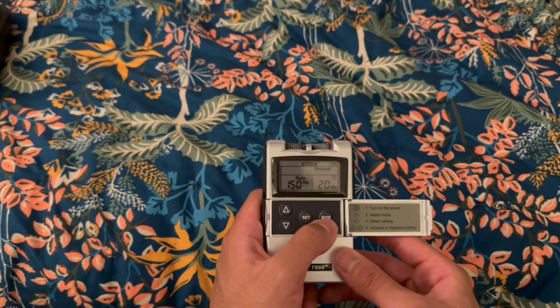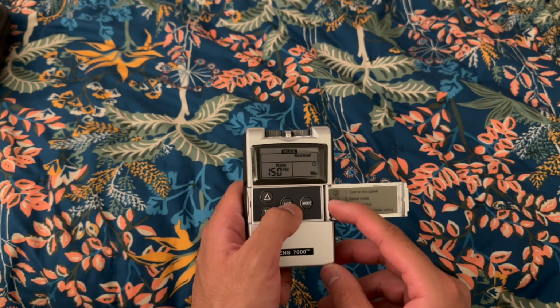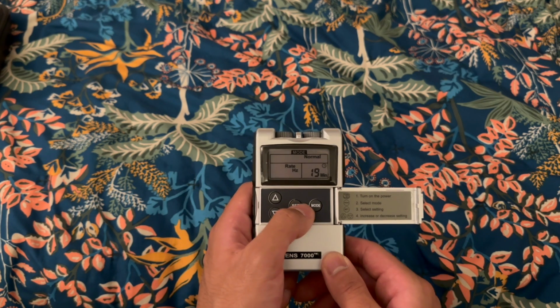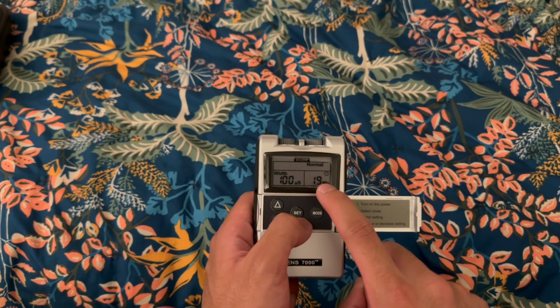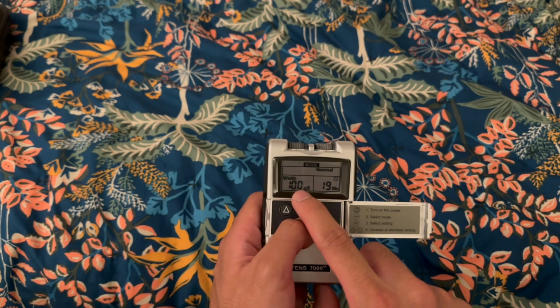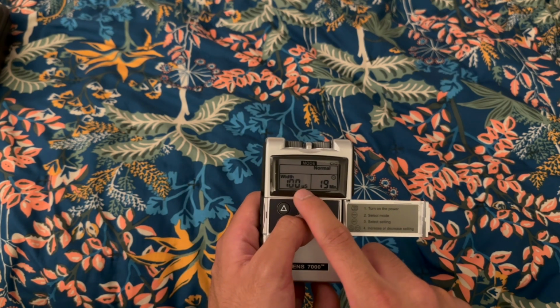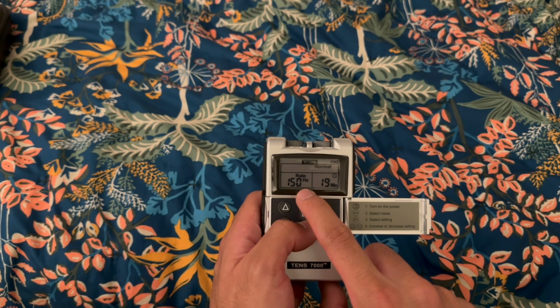But a person who has this at home can go ahead and set it as long as they want to receive their treatment. So these would be our parameters for conventional, with time being the adjustable parameter based on what the patient would like. And obviously with width 50 to 100, rate 30 to 150 hertz.